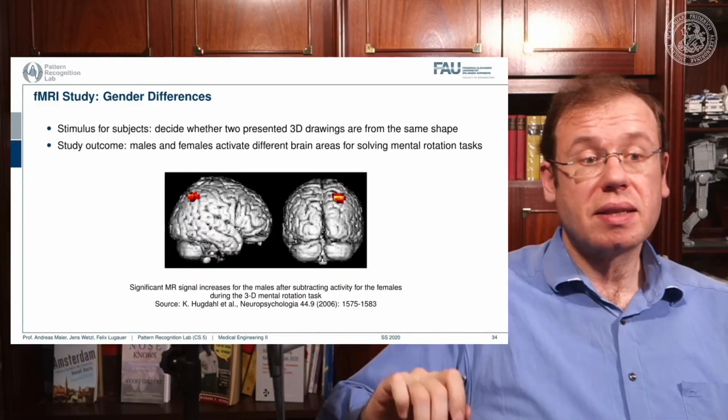Very well. This already brings us to the end of this presentation. Now you've seen how we apply imaging in MRI. You've seen that we are essentially changing the gradient coils in order to introduce changes in the magnetic field that are locally different. We can use that for slice excitation. With that we can select a specific slice direction, and only the voxels within the slice are excited. Then we can read them out, and in order to figure out in which location they actually are, we use an additional gradient before the readout to introduce a phase shift.